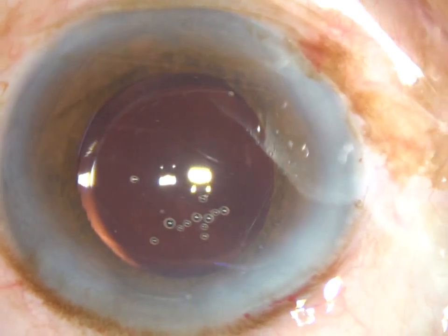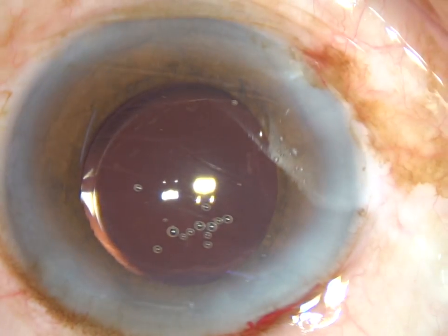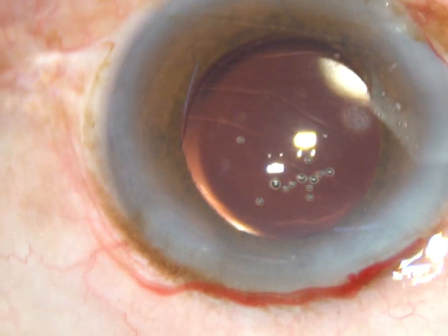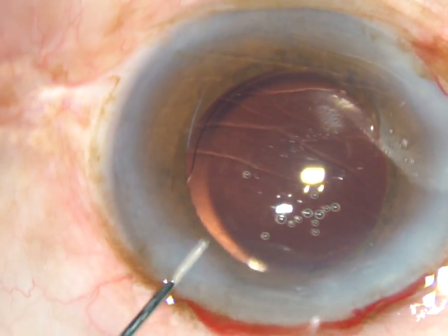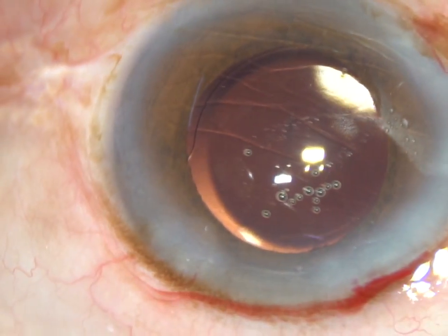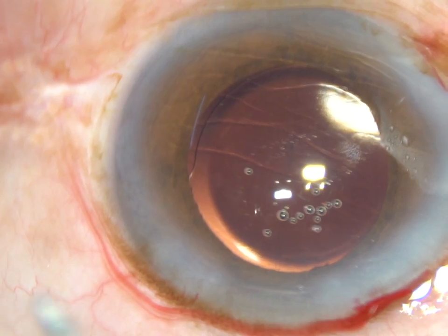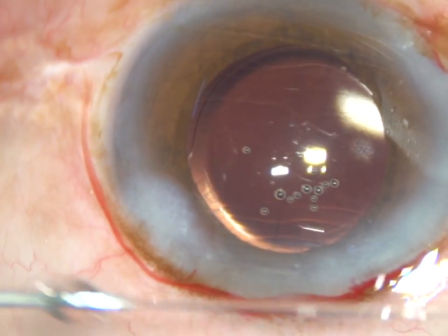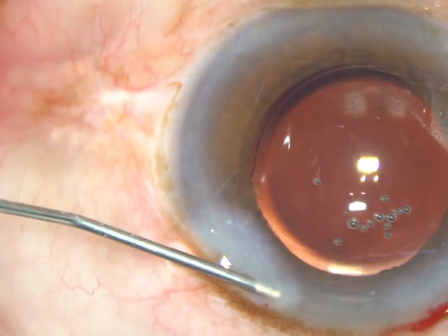So the intraocular lens has been implanted, keeping the anterior chamber formed by BSS. We can call it hydro-implantation of the intraocular lens. This is a monofocal hydrophilic acrylic intraocular lens.